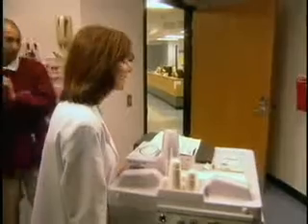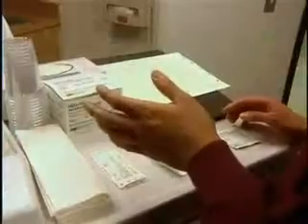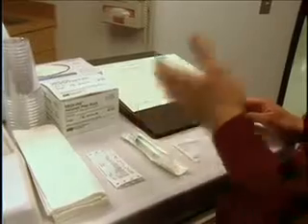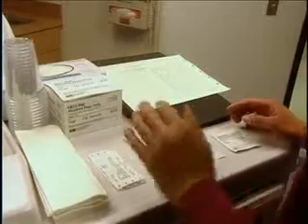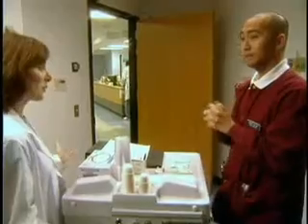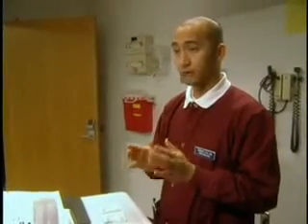Okay. Thanks, Robert. Looks like you've got all of your supplies. Yeah, I think I do. The MAR, of course, the medication, a needleless syringe, the volume control set, which is already in the room, and alcohol swabs and a medication label. Very good. So, first? Well, first, I checked the MAR against the medication order.